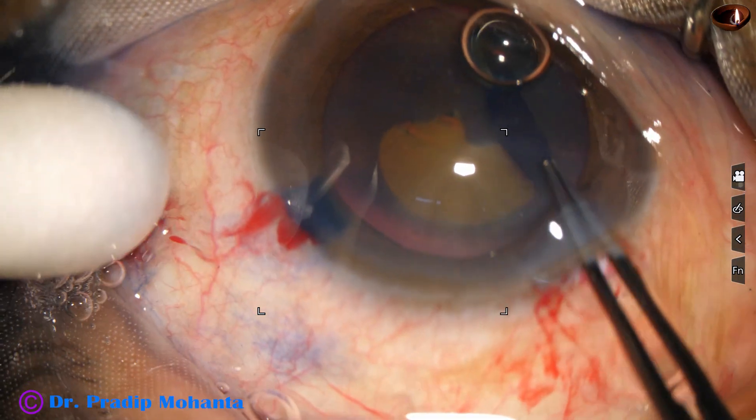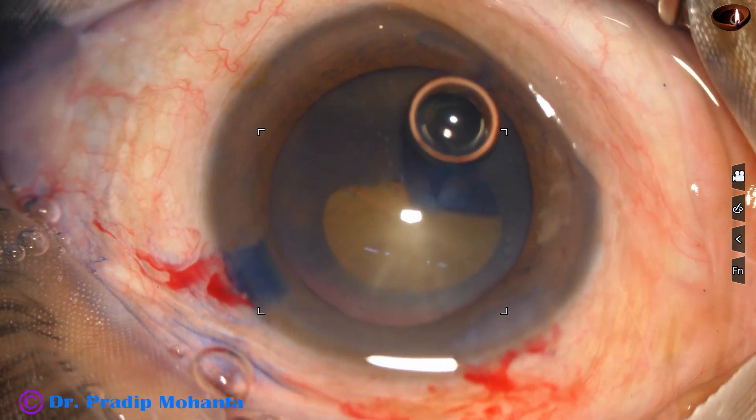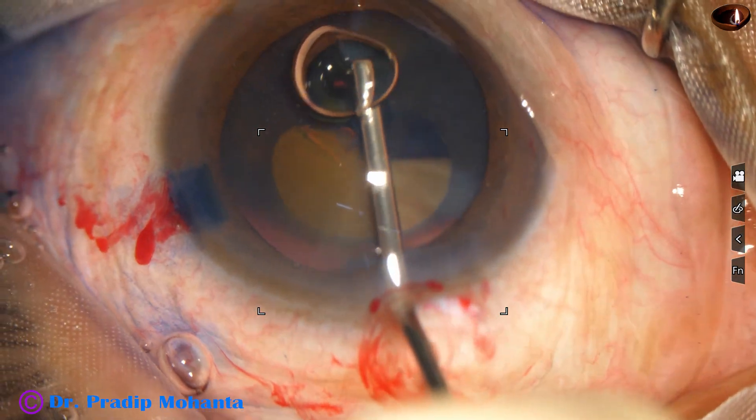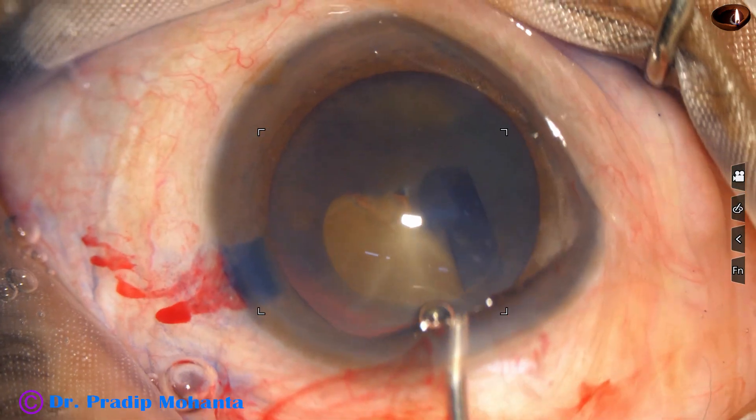Capsulorhexis is being done with the help of Utrata forceps. At this time, the air bubble is going to disturb, so I use viscoelastic and remove this air bubble.